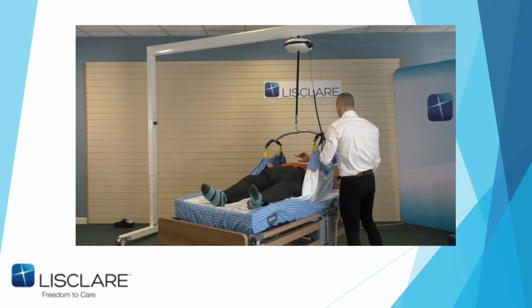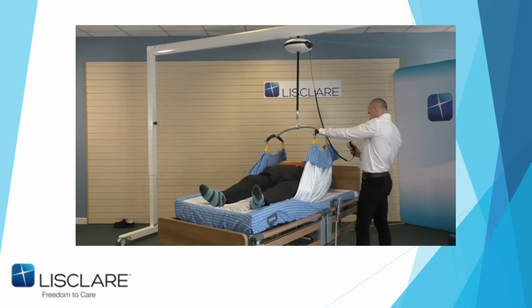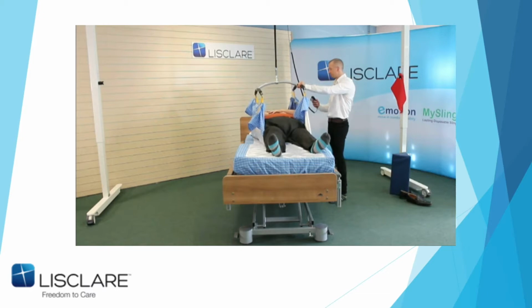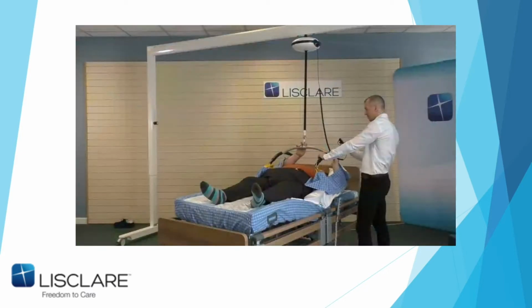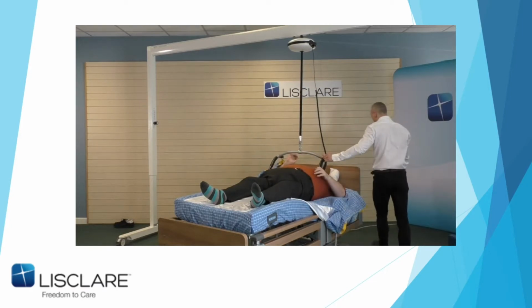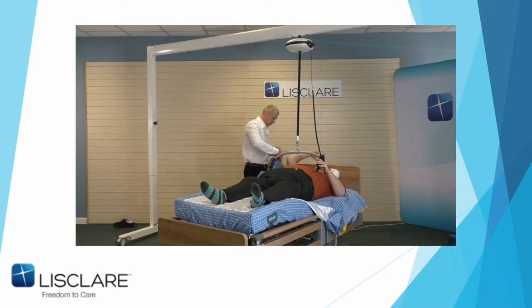Now, John now lets the hoist take the weight. Everything's in correctly, John. And there you go. And back down again. And that is actually put, and John will witness it, I am now about an inch from the top of the bed. Okay, thank you, John. We take that off. And John, if you take that over here, we'll change that to the standard spreader bar, please, if you don't mind, which is sitting just behind.